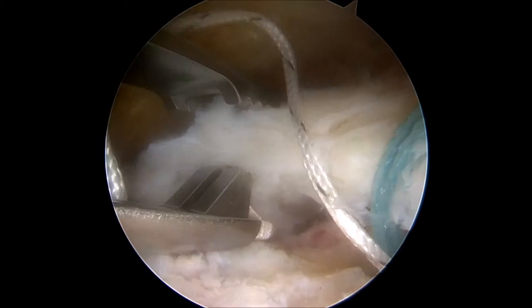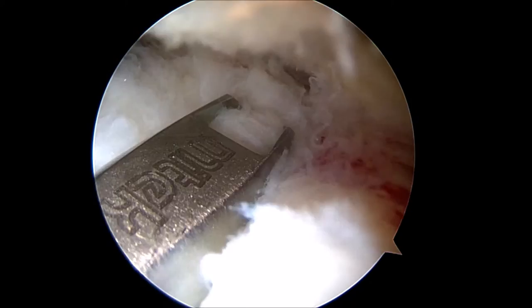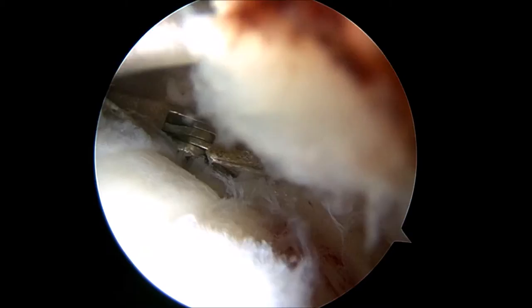Next, this instrument is used to pass suture through the undersurface of the rotator cuff tissue and onto the top surface of the rotator cuff tendon. Here you will see one of the white sutures being fired through the rotator cuff tissue. All four sutures will be passed in this manner in anticipation of knot tying.